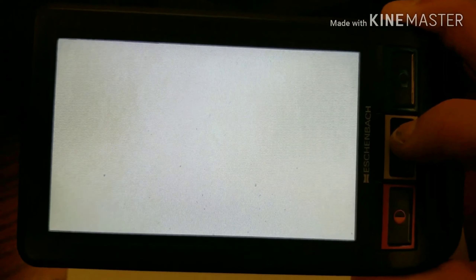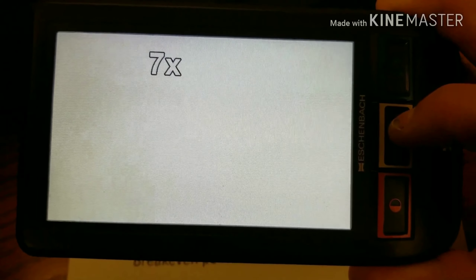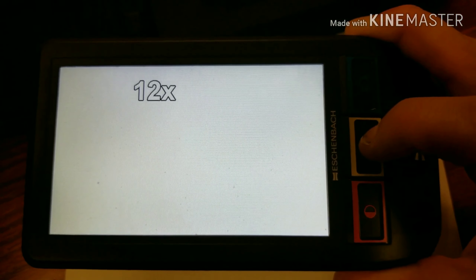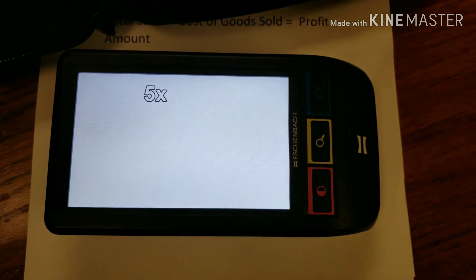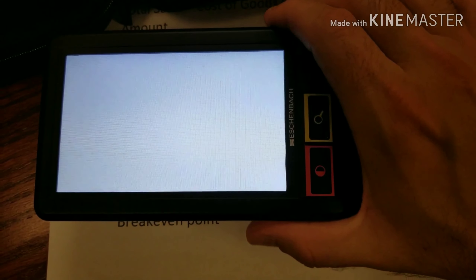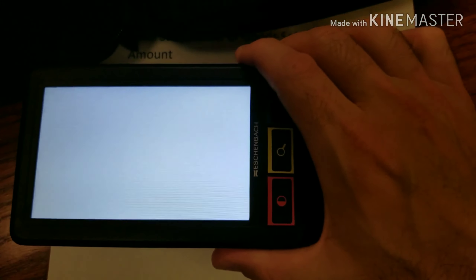Here's my problem with this device: it doesn't have a 1.5x or 3x magnification — it jumps straight into 5x, then 7x, then 9x, then 12x. Sometimes these settings are good, but sometimes you don't need it to be that zoomed in. Being visually impaired myself, it's super annoying when things are zoomed up more than they need to be. Sometimes you're looking at something just small enough where you can't read it and you only need a tiny bit of zoom.